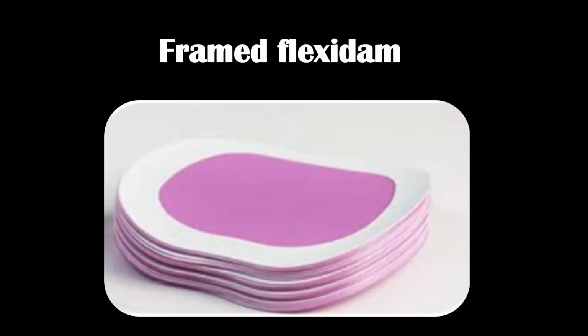They were once upon a time available. Framed flexi dam. Now this is a great option if you are visiting and you travel frequently, and it's a very nice way to declutter your armamentarium. It already has a frame incorporated into it. So all that you have to do is use a rubber dam stamp to stamp onto that, and you have the entire arch.